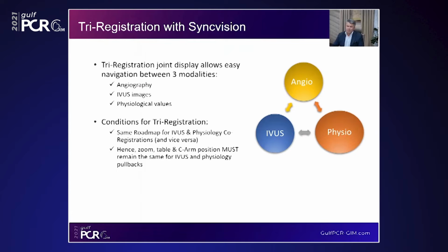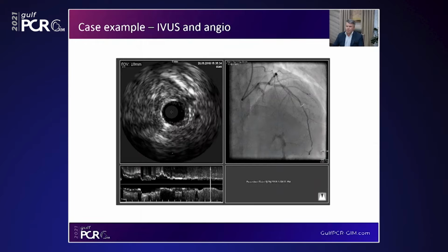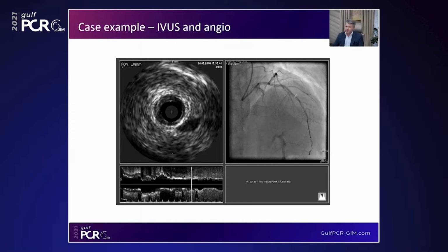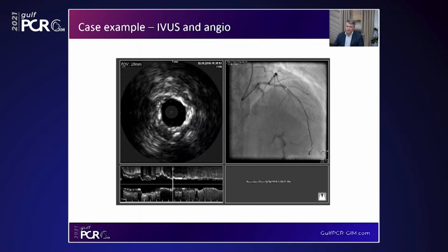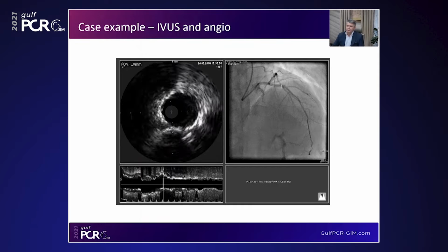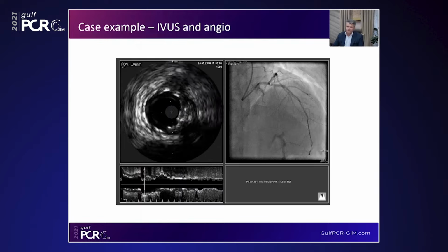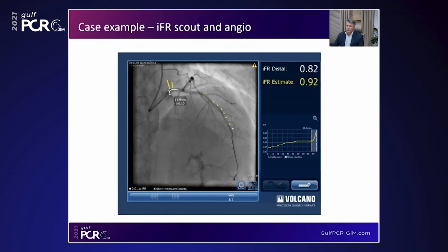But I would say that looking at the newest technology, the combination of angiography, ultrasound and physiology gives you additional opportunities for your intervention. It's a kind of pre-procedural planning and intra-procedural monitoring with advanced imaging and physiology assessment. A few years ago, we started with the co-registration of angio and ultrasound, which gives you a very good understanding of where you are and what you can see. When evaluating the stents, you see very precisely, much better of course with ultrasound than with angiography.